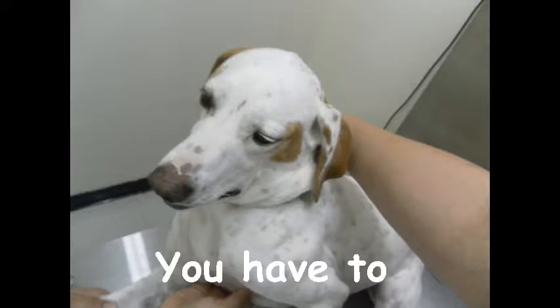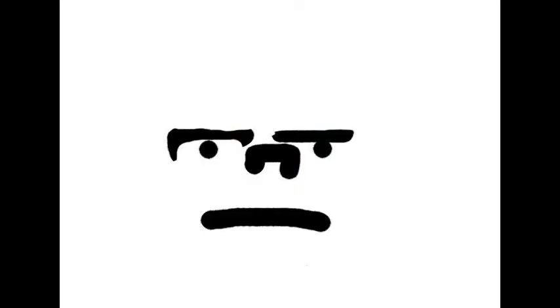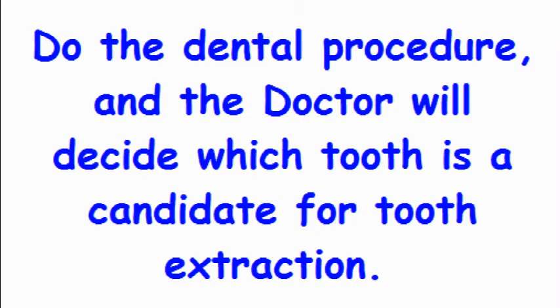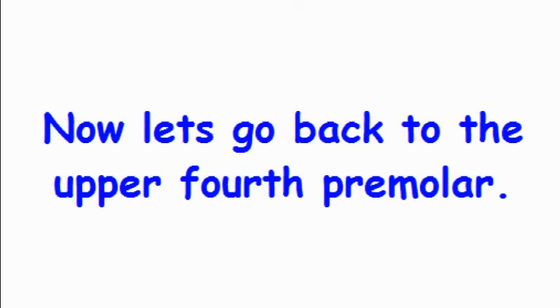First, you have to anesthetize the animal. Then you've gotta do the dental procedure and the doctor will decide which tooth is a candidate for tooth extraction. Now let's go back to the Upper 4th Premolar.